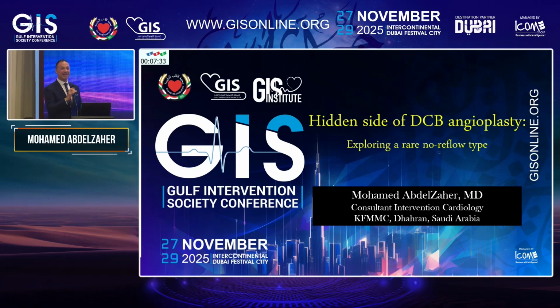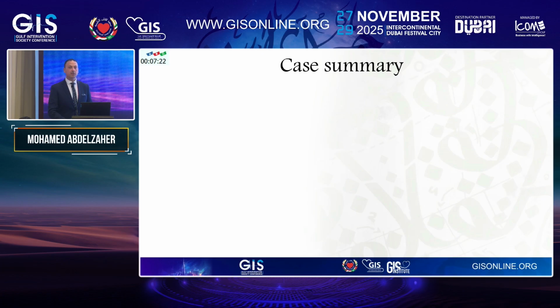So let's go for the hidden side of the drug-coated balloon. It's not all positive. Sometimes we have some complications, some rare, some common. So let's discuss the case together. So this is my case.